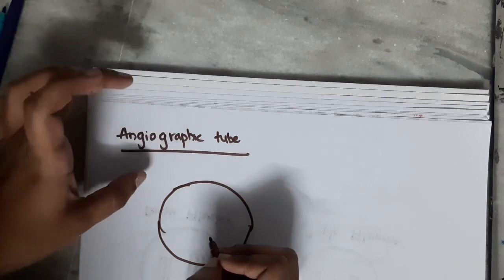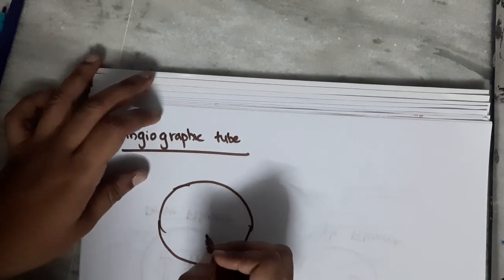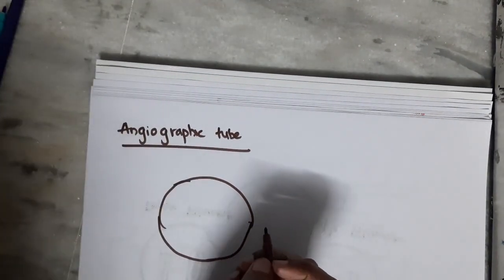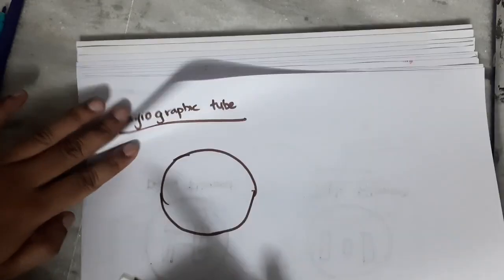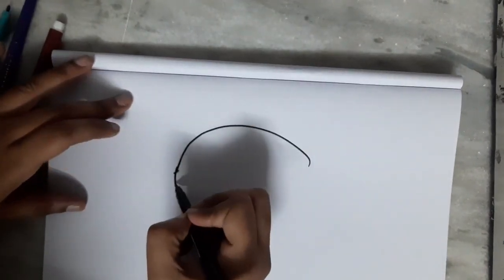In angiographic tube, we'll learn about this angiographic tube in the incoming lectures, because it is a little complicated. So this is about the main things about the X-ray tube, cathode. One more important thing about the cathode is that, let me draw the X-ray tube once more.